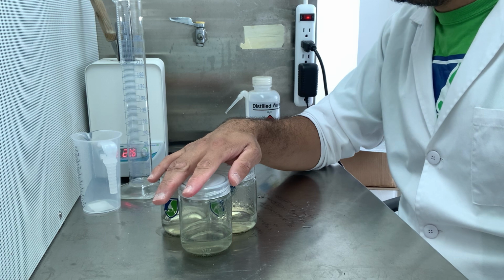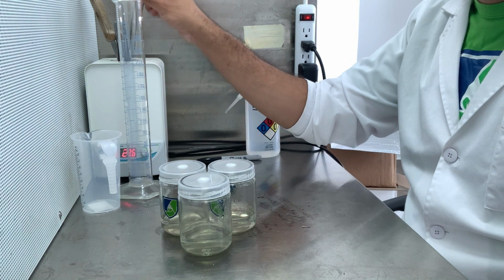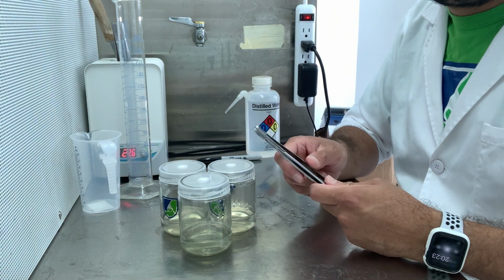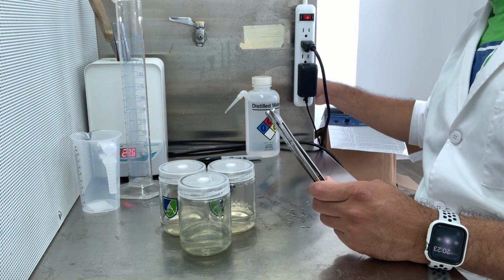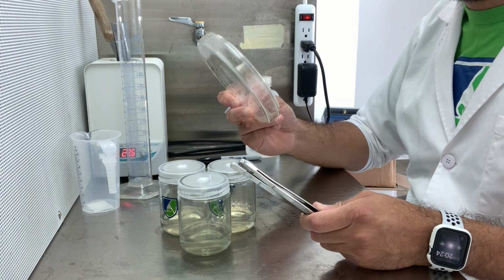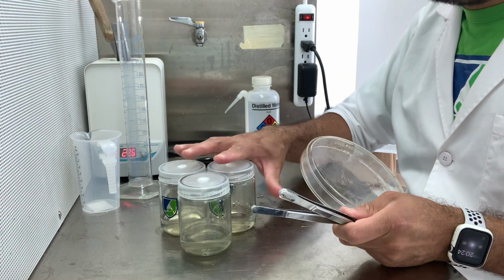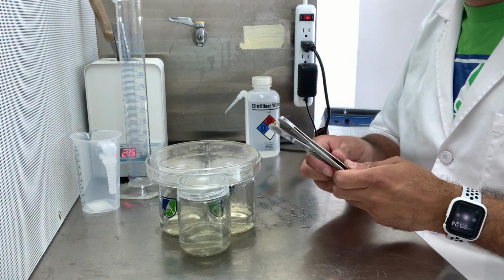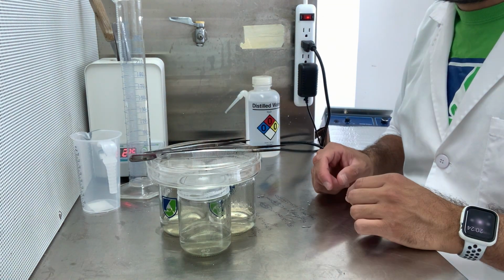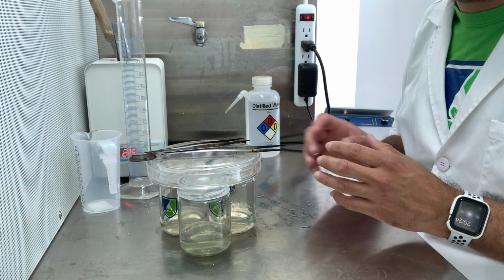Anyways, I hope you have enjoyed this video. One other thing you can do if you want to put this in the pressure cooker, take your forceps and wrap them in some foil, as well as your cutting plate. Use a large petri dish that I need to wash. Wrap them in foil as well. So whenever you load your pressure cooker, you have your flask, you have your plate where you want to do your cutting or divide your plants, and then you have your tools, your forceps or your knife, and that's pretty much everything that needs to go into the pressure cooker.